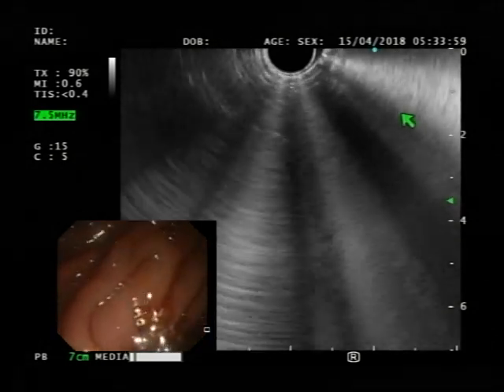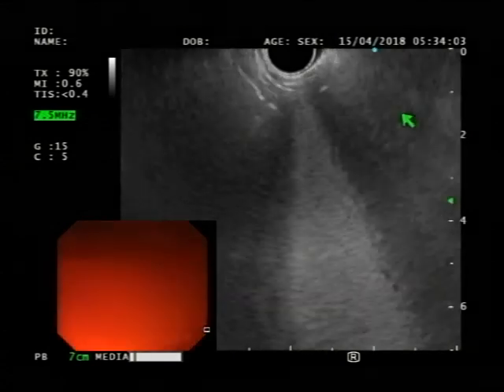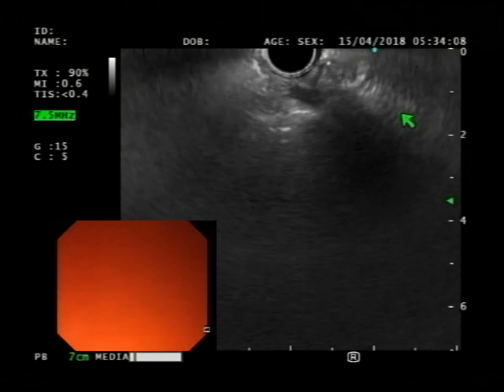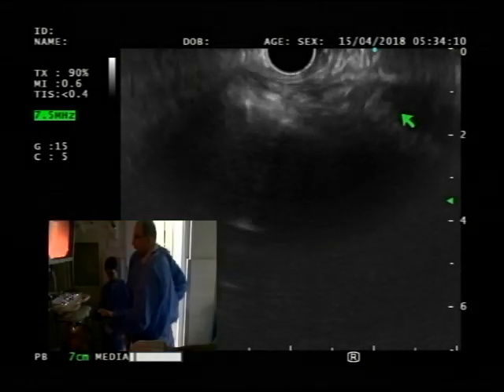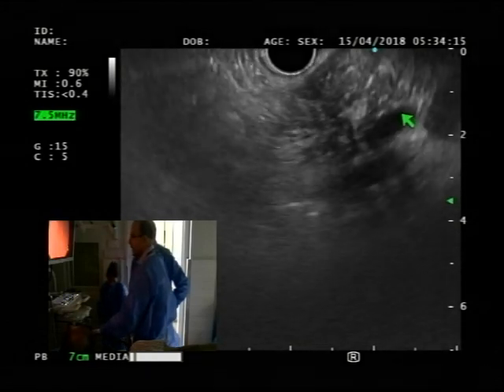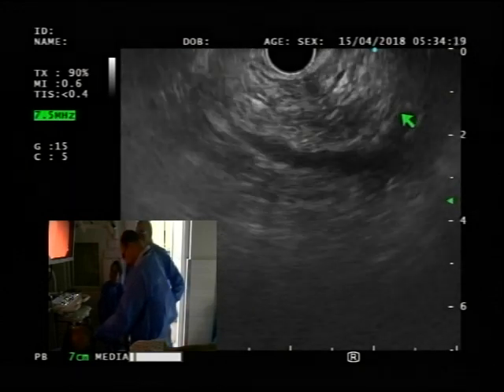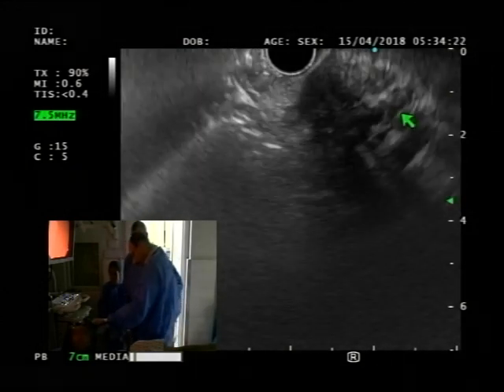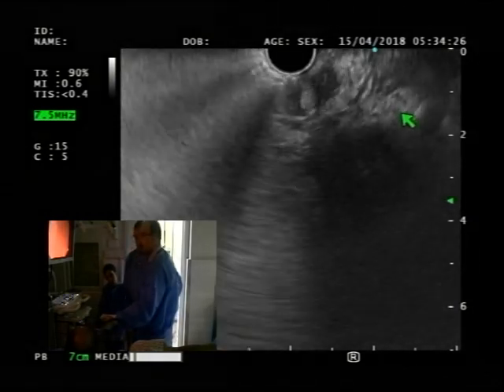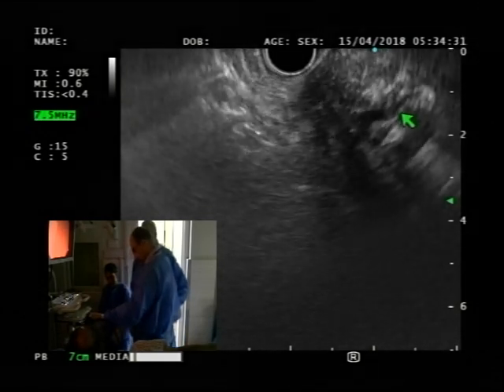I just want you to look at my hands when I do this, okay? So, aorta, that means I need to pull back. So I just gently start spinning clockwise, and there it is. And this one, so right here. So look at this. Relaxed, supporting the shaft of the scope, clockwise, counter. Right. Clockwise, counter. So I'm not even grabbing the scope with my right hand.